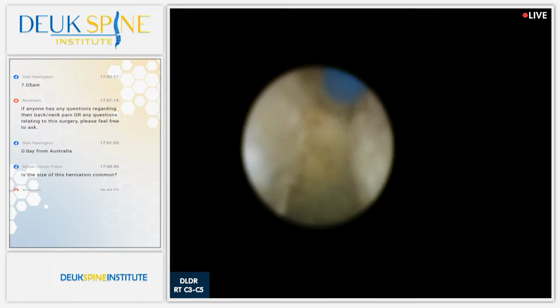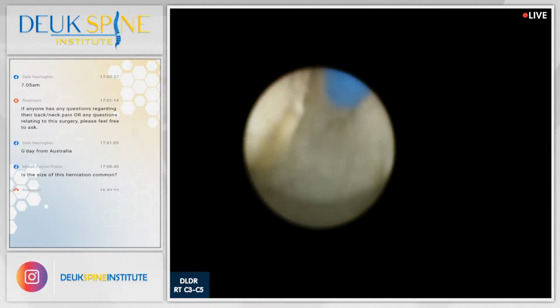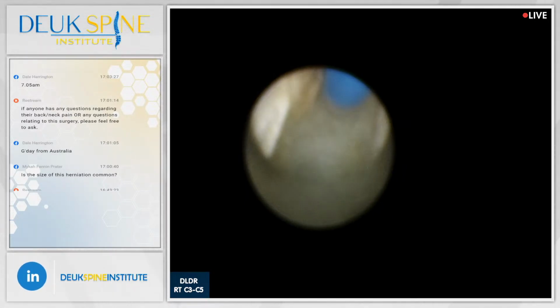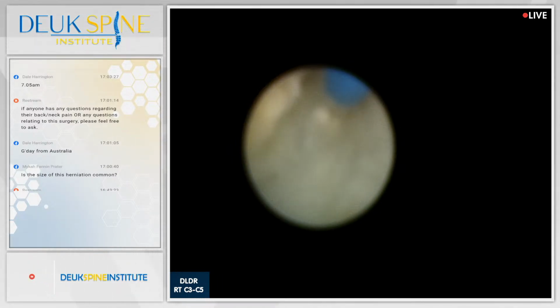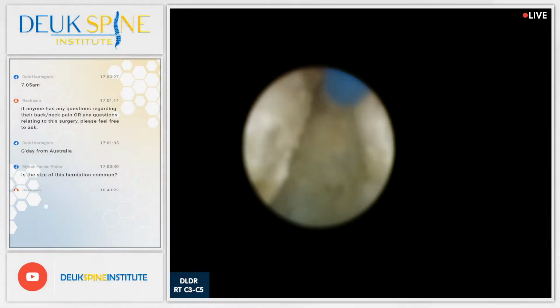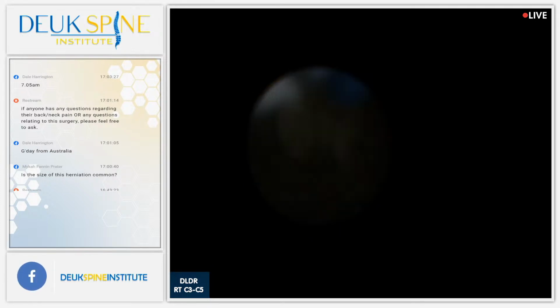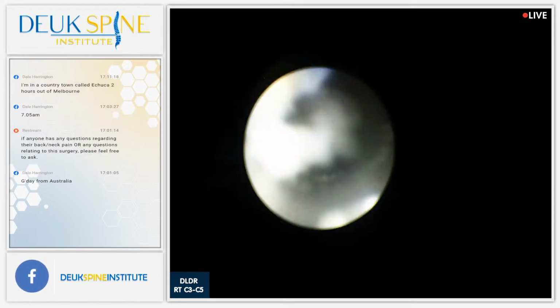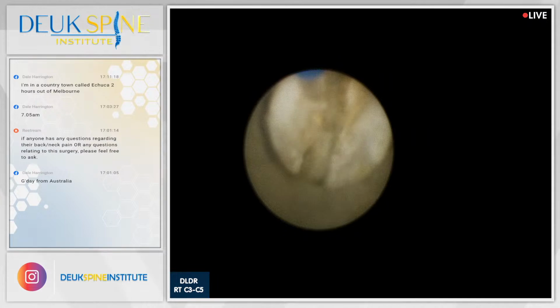All right, I'm messing around in the foramen here. I can't tell what I'm seeing. It sort of looks to me like it could be scar tissue versus herniation. If it's scar tissue, I kind of want to leave it alone, but it looks like there's a little bit of herniation in there. Yep, sure is. Look at that. And that's really it. Look at that. Came out. That's as probably as clean as I can get this. Take one more peek.